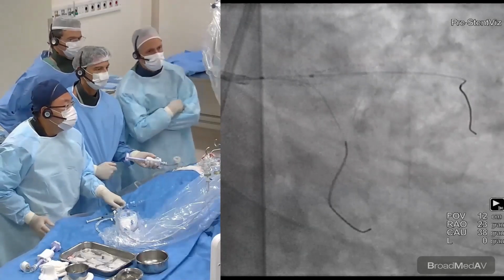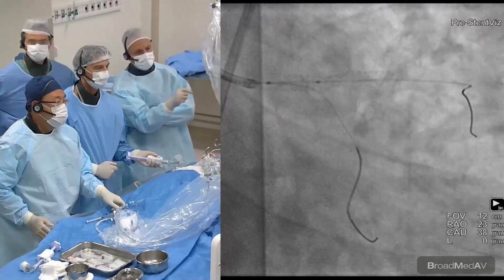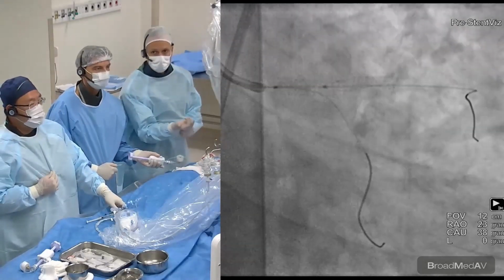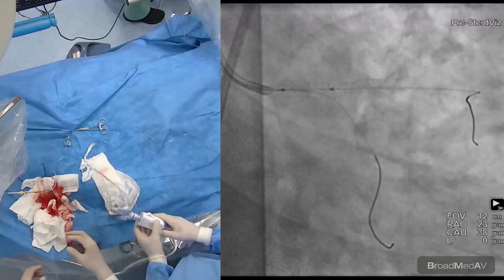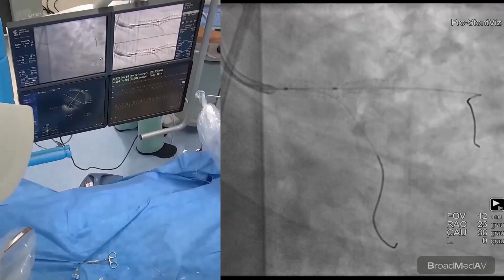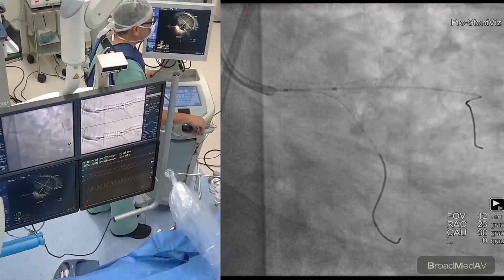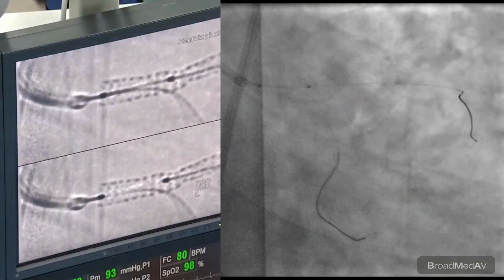So just see how we are exactly at the level where the wire of the circumflex is. Can you show moving out this stent vision? Can you show the reference here? If you cannot, maybe use this camera and show us in the room, in the lab, please. Okay, great. Yes, just do a zoom right here, that's perfect, exactly. Once we completed this step, great, thank you.